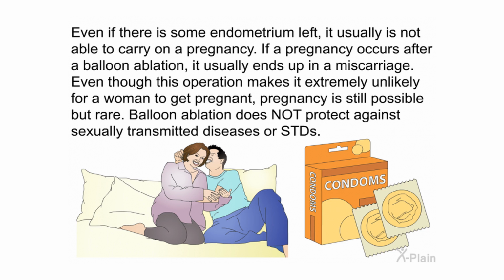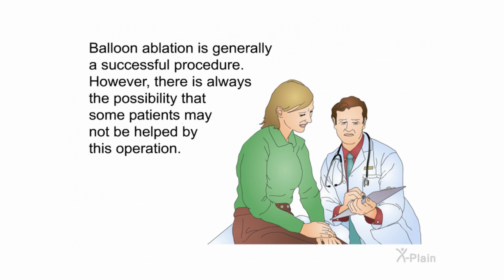Balloon ablation does not protect against sexually transmitted diseases or STDs. Balloon ablation is generally a successful procedure. However, there is always the possibility that some patients may not be helped by this operation.